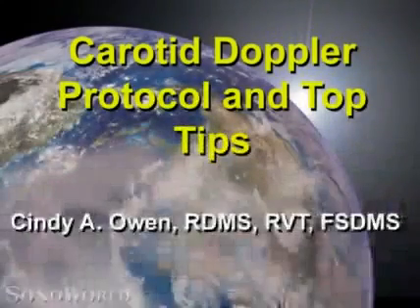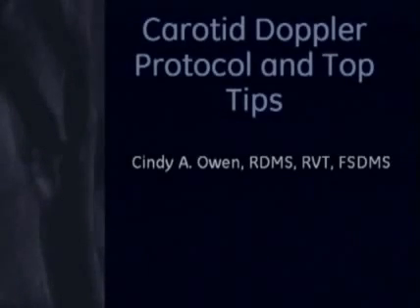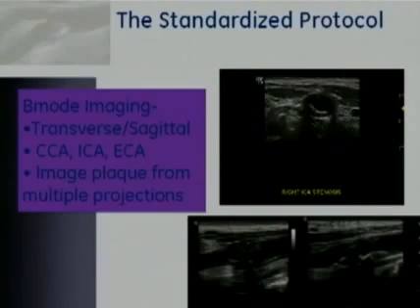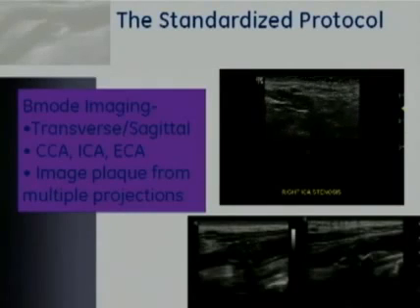Been a sonographer for about 30 years, and currently I work with GE Healthcare as a Global Luminary and Research Manager. My topic today is carotid tips and protocol. I'm going to talk about carotid Doppler protocol and some tips for performing the exam. What I'm going to start with is the standardized protocol.